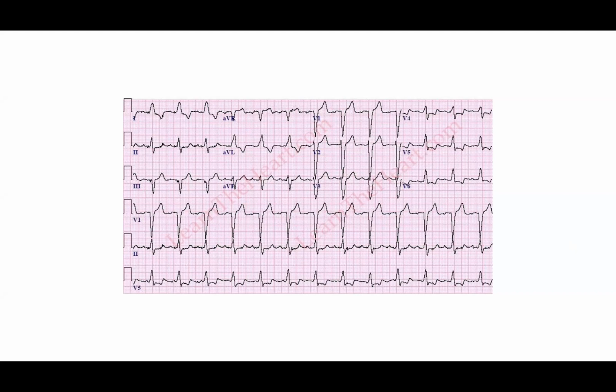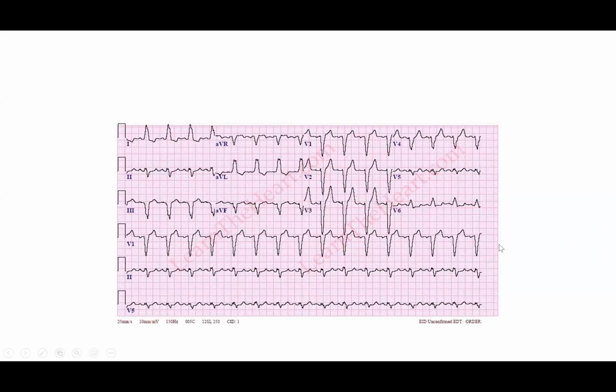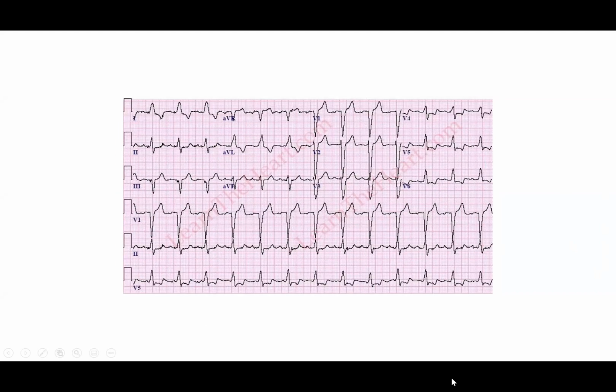So, not sure, did we do this one or not? Can't remember. We'll do it again. So, let me get my pen out here. Let's just go over everything in a systematic approach, right?